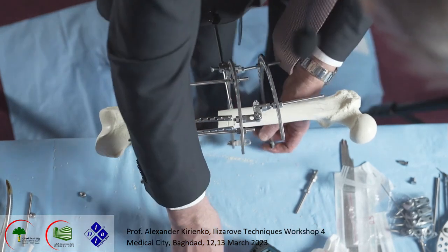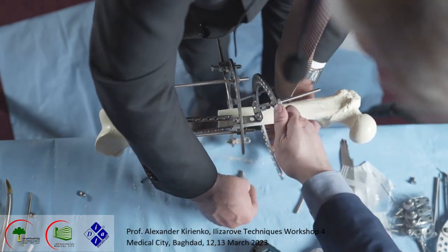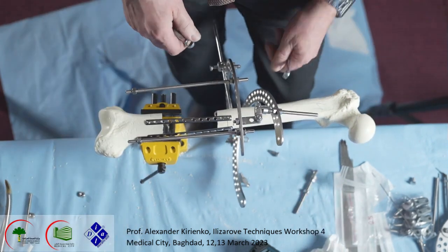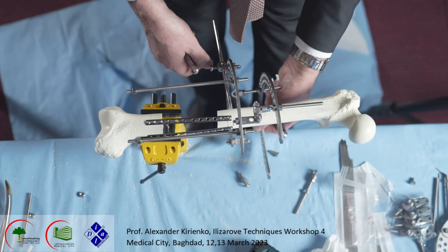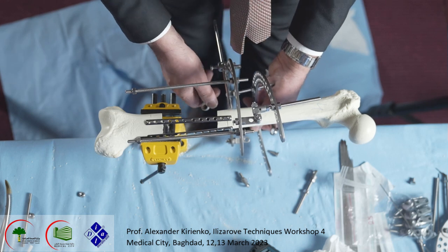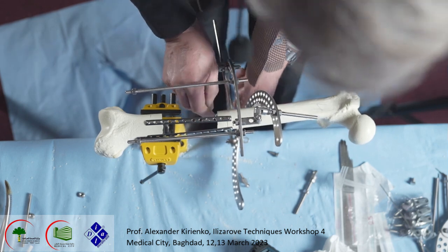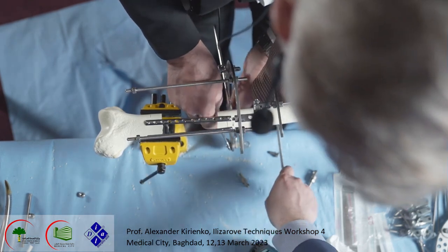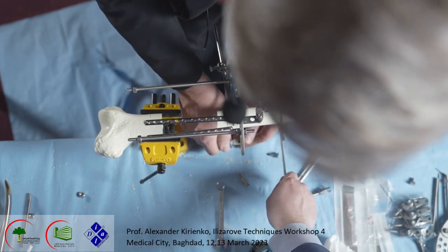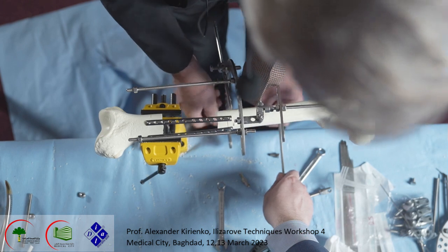I do another one here, posterior, bolt and nut here. Better, one second, may do it differently. Because we can't put the rod more posterior, it will be so bulky and uncomfortable for the patient.